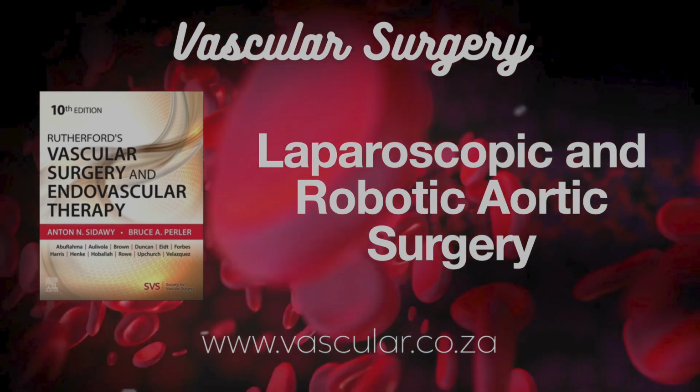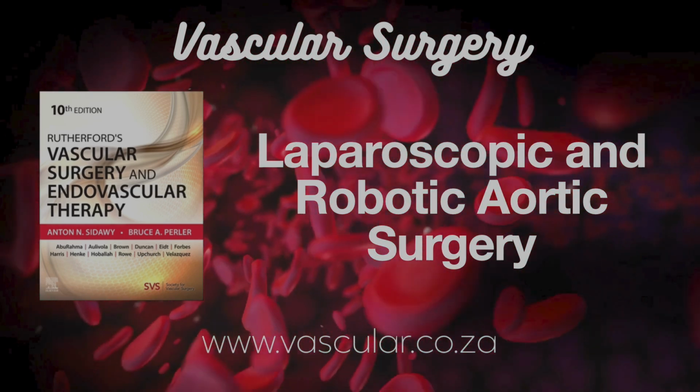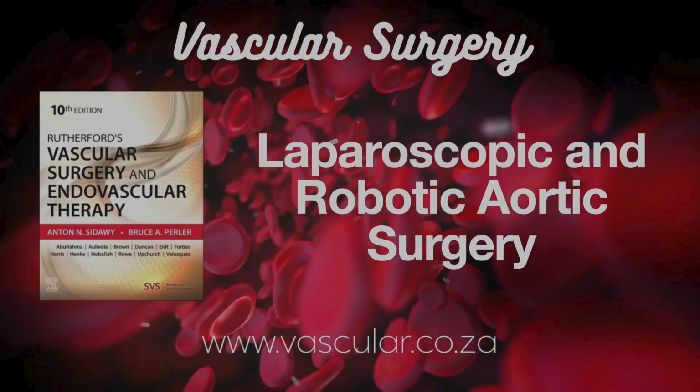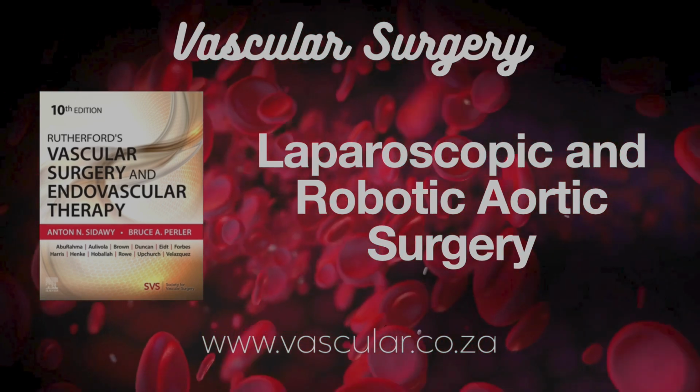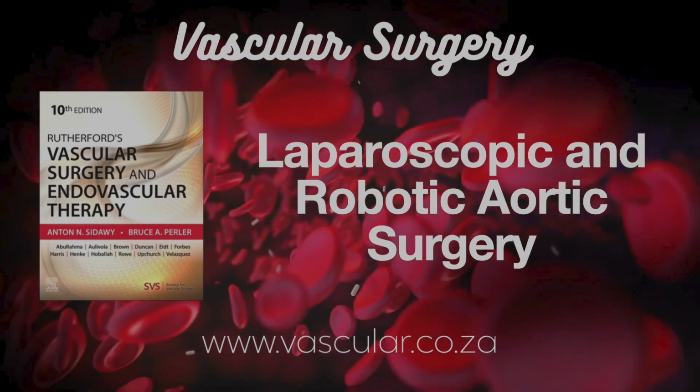But it's a bigger incision than TLAS, right? That's the trade-off. It's more invasive than TLAS because of that hand port incision. So it's balancing the benefit of touch against minimizing the incision size. Right, always a balance. Okay, now on to the really high-tech stuff.